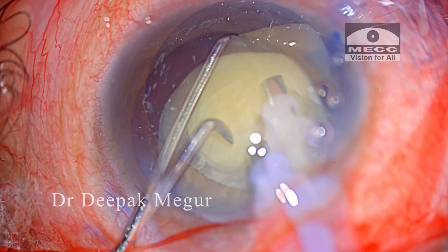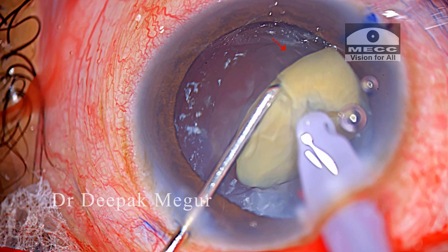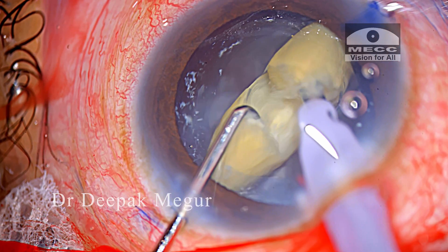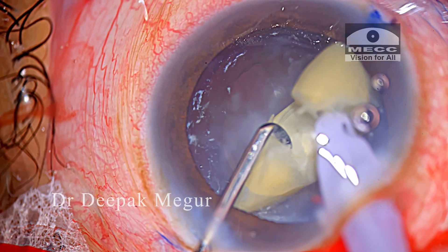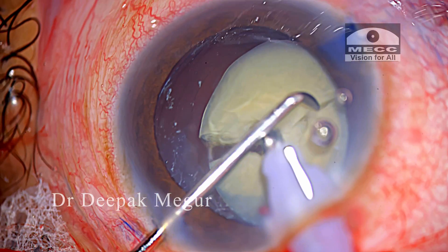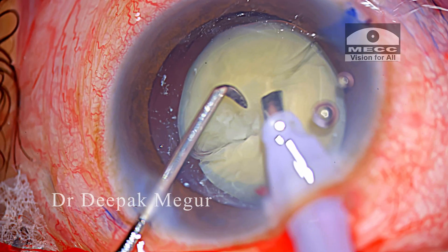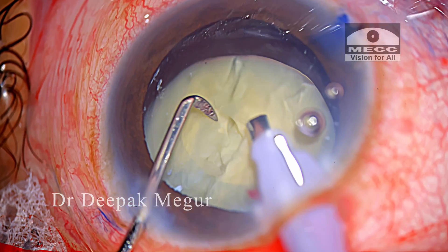As I am trying to chop the nucleus, I can see these lines in the posterior capsule — it looks wrinkled, or there are stress lines. I do realize that the nucleus manipulation is inducing significant stress on the posterior capsule and also the bag.